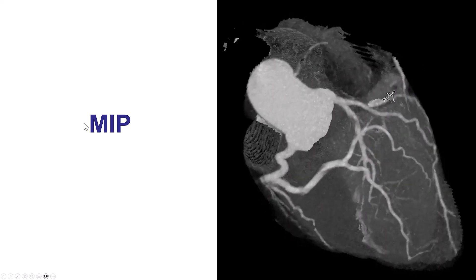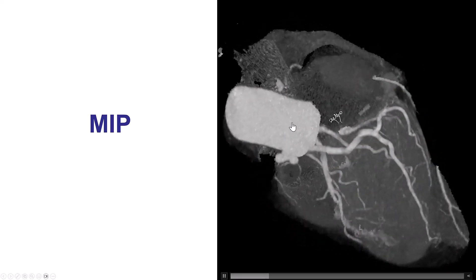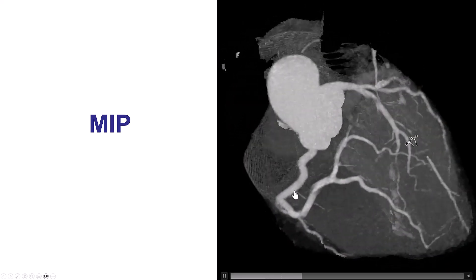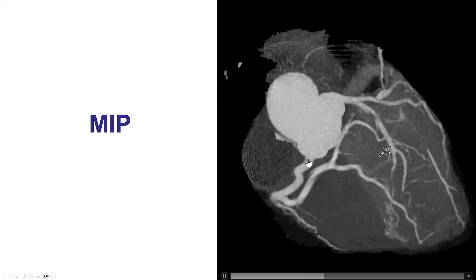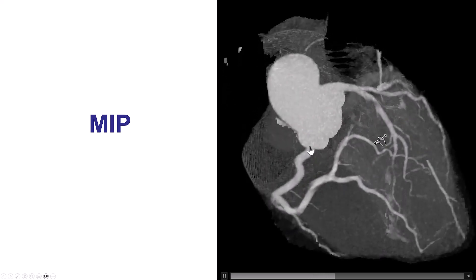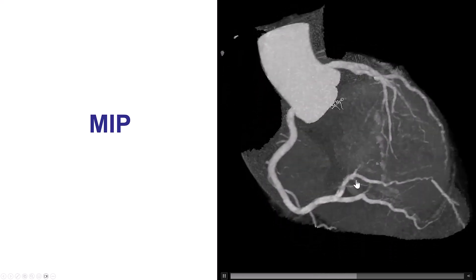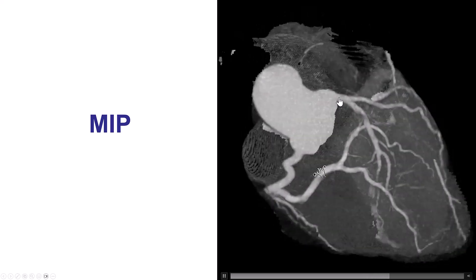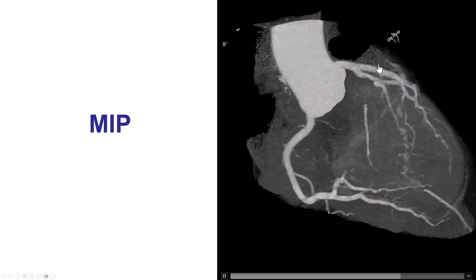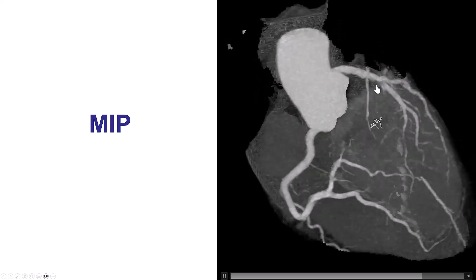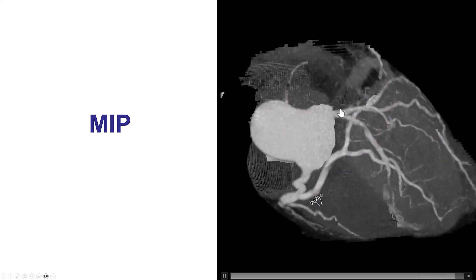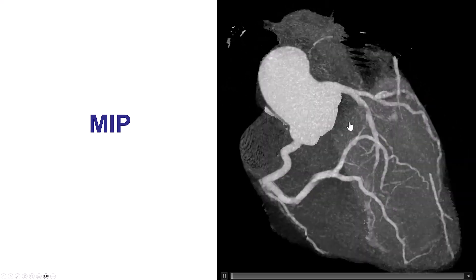These are the MIPS — the maximum intensity projections — essentially an easy, automated way to get a sense of the entire coronary tree. We do see the right coronary artery without any significant stenosis. However, we do see that the proximal LAD has an area that appears to have a filling defect. There is artifact in the circumflex, but no significant stenosis there as well.